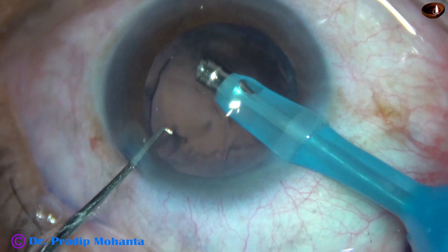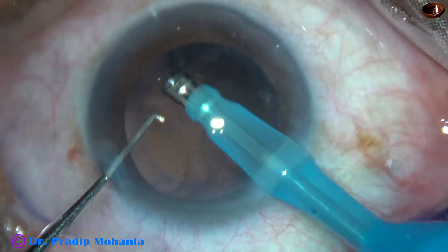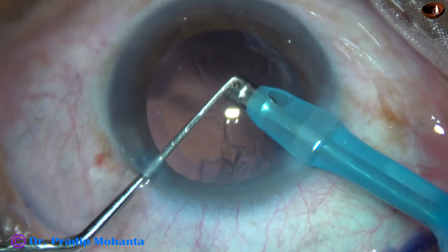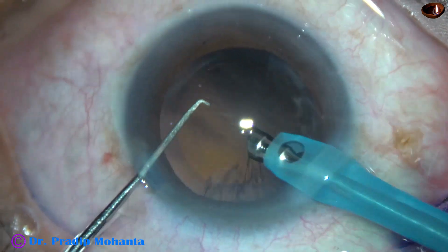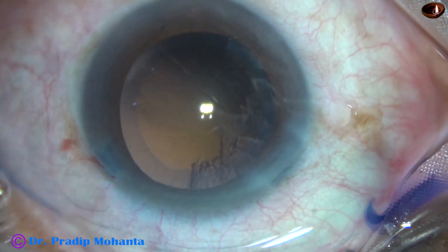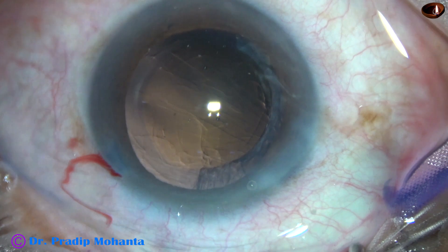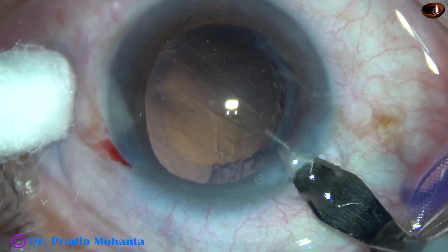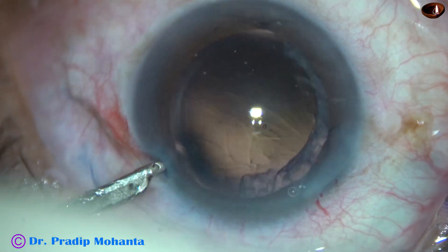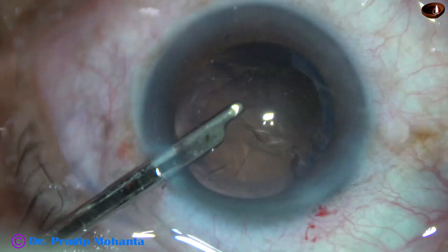The cortical lens matter is being removed partially by the phaco needle itself. At this time the vacuum has been reduced to 200 and flow rate is 20. After removing half of the cortical lens matter, I decided to come out and inject some visco and use the 23-gauge Simcoe to remove the rest of the cortical lens matter. Before that, this is enlargement of the main wound by 0.2 mm, because I am going to use a B cartridge. And now here is the removal of the rest of the cortex.